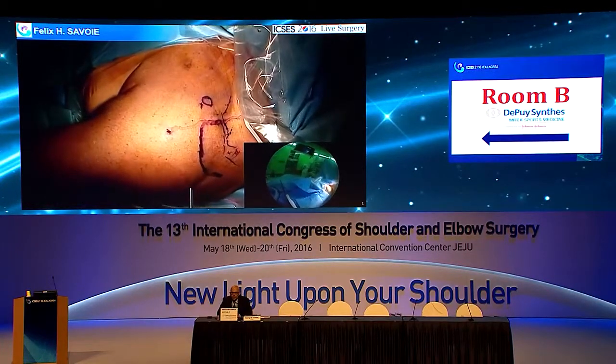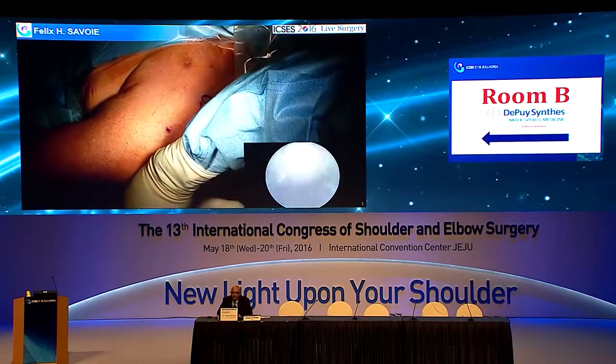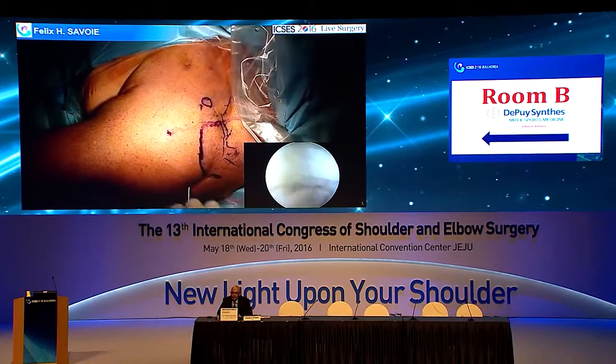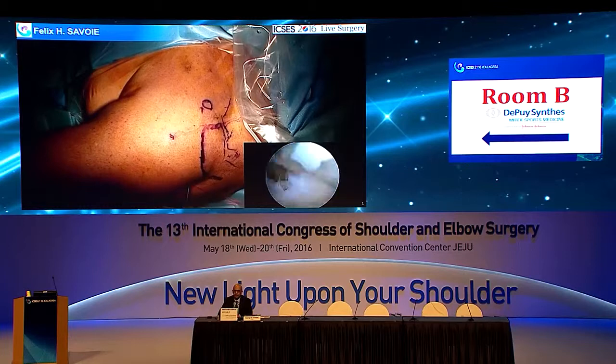into the shoulder. Do you have traction on the shoulder right now? Just a little bit, not very much. It's a spider, so it's not, you know, I trained with an arm holder where we put actual traction on, and we use 5 to 10 pounds.